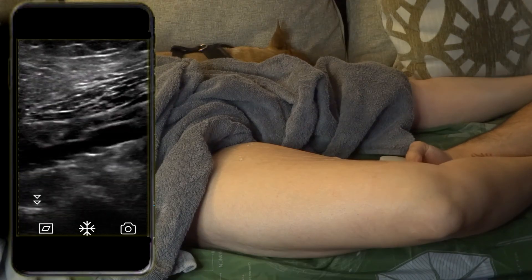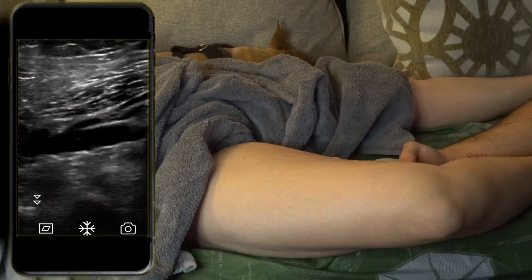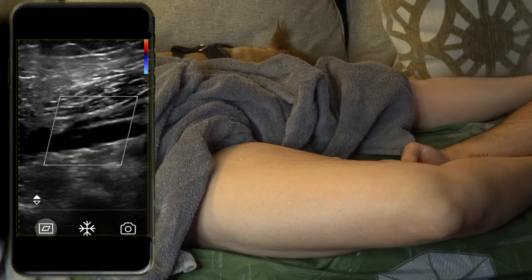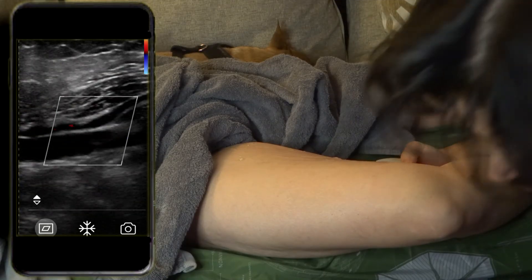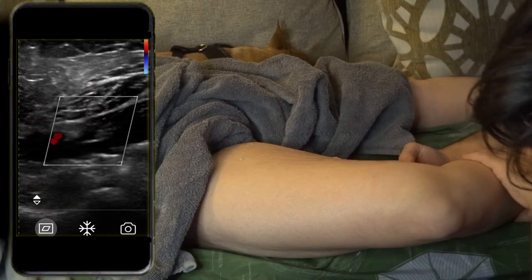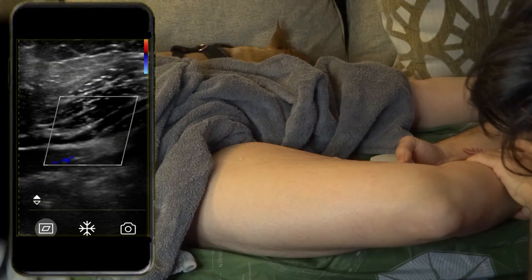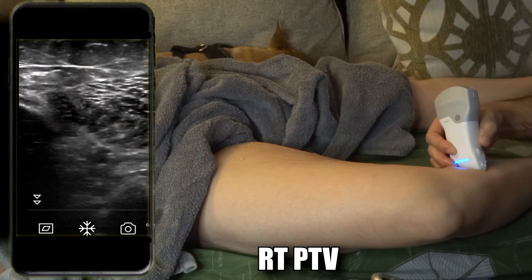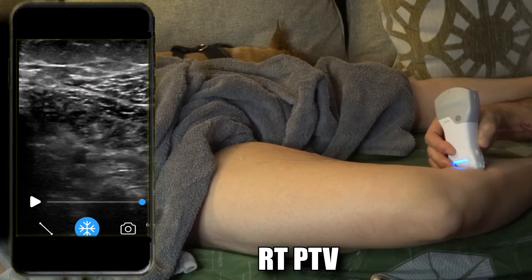You can see the lesser saphenous vein coming off the popliteal — it's usually going to be the lesser saphenous vein. A little more distal you have the tibial peroneal trunk, which includes the tibial and peroneal veins, and also the anterior tibial vein. I'm going to stop here at the posterior tibial veins and do another video on how to get those other three veins. If you go a little further down into the medial calf right next to the tibia, you'll be able to see the posterior tibial vein — it's usually one artery and two veins next to it.